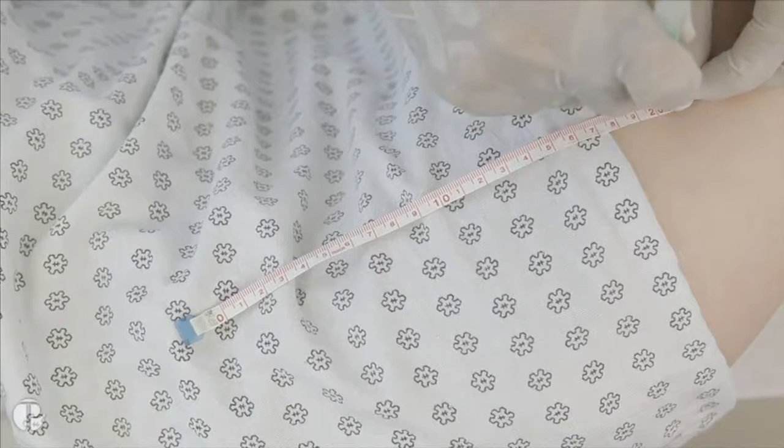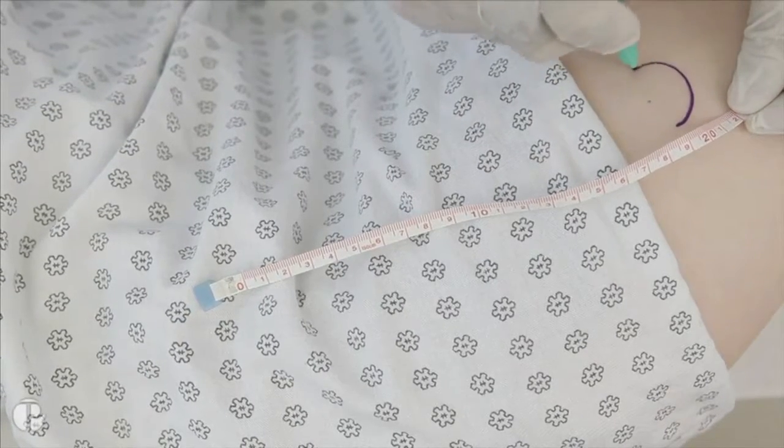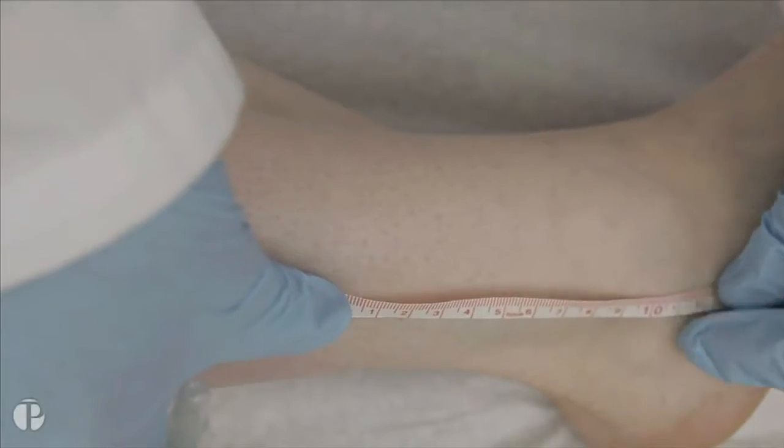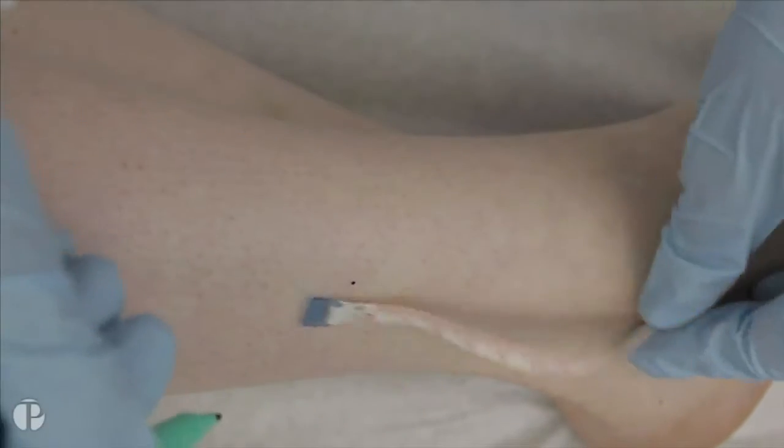The thigh site is located 20 cm below the iliac spine at the level of the pubis. The distal leg or calf site is located 10 cm above the lateral malleolus.